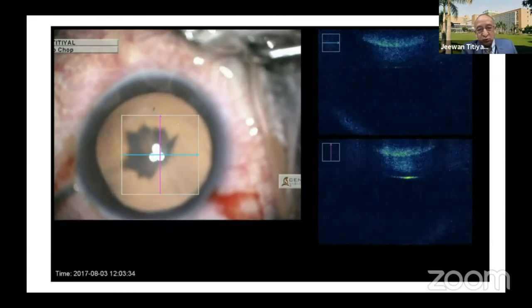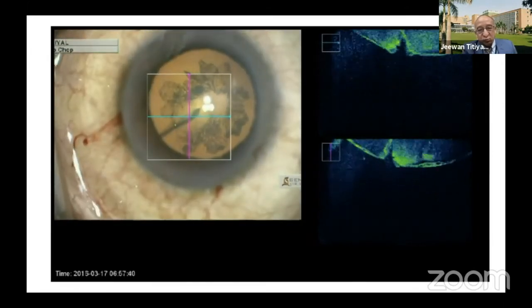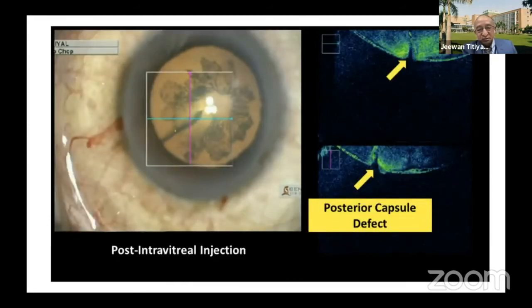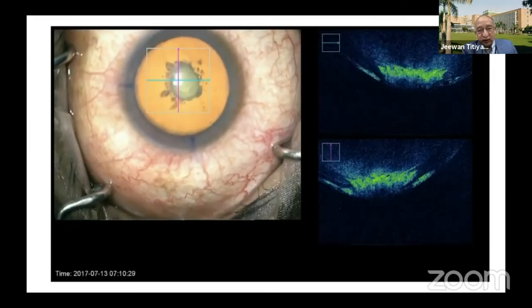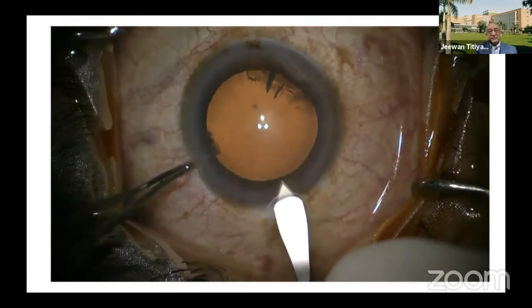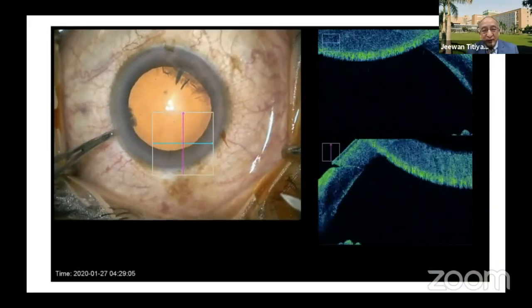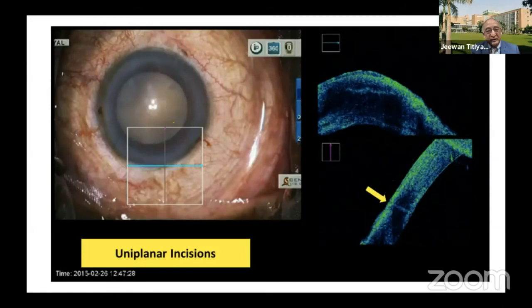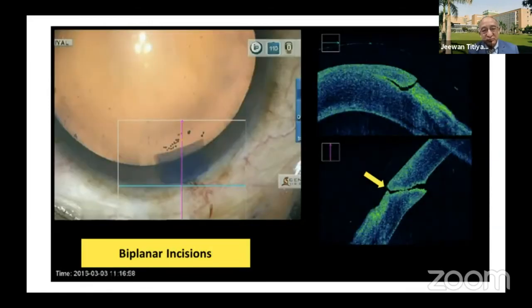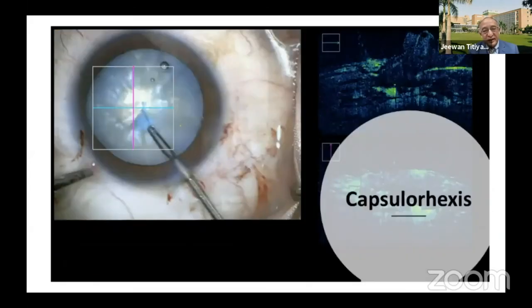In post-traumatic cataracts, you know the depth of opacity also, nuclear or deeper. Sometimes an injury in the posterior capsule can be picked up, like in this patient, post-injection. And in posterior polar cataracts, it gives you the morphology. Incision-wise, it helps you to see what type of incision we have made. This is a uniplanar incision. You can have a biplanar or triplanar incision that can be assessed very clearly. This is a biplanar incision done by keratome. With femtosecond, you can see a three-planar incision. And after surgery also, you can assess the incisions.